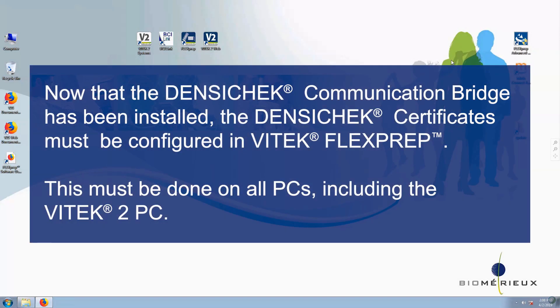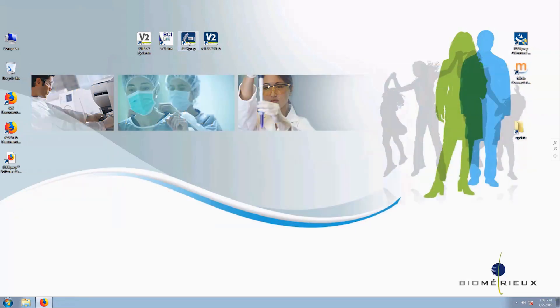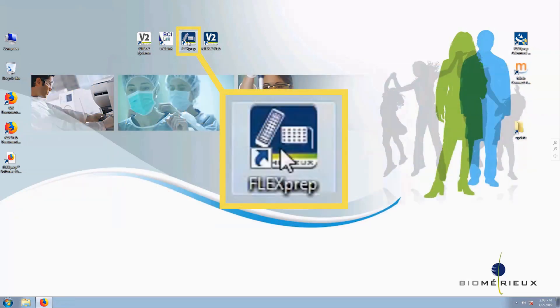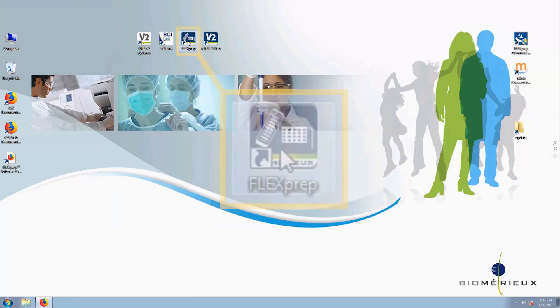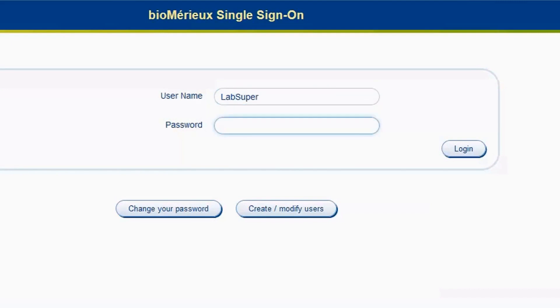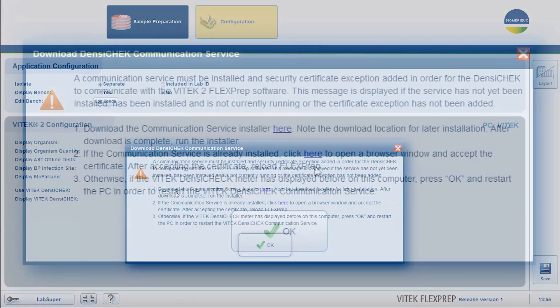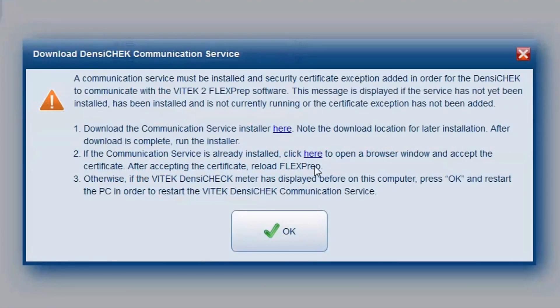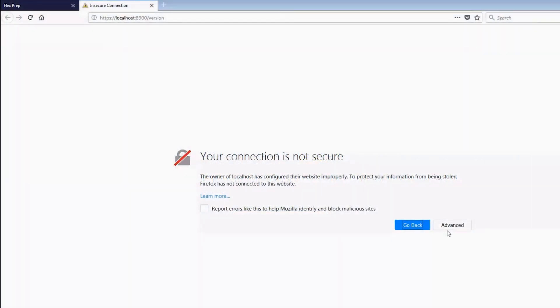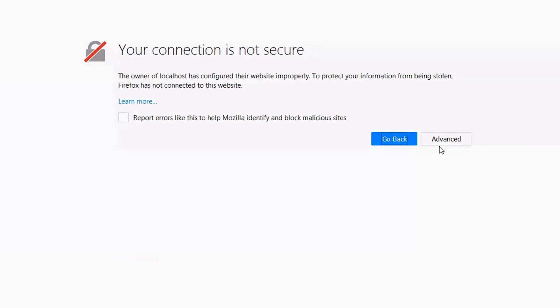Now that the Densichek communication bridge has been installed, the Densichek certificates must be configured in Vitek FlexPrep. This must be done on all PCs, including the Vitek 2 PC. Open Vitek FlexPrep by double-clicking the FlexPrep icon on the computer desktop. Log in as a supervisor or administrator. By default, the sample preparation screen will display. A warning pop-up will display. After reading the instructions, follow Step 2 by clicking Click Here. A tab appears stating your connection is not secure, indicating the certificates have not been accepted yet.